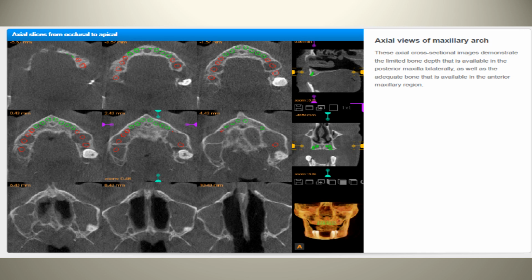And from the cost perspective, when you start breaking down the business side of the profession, a typical CT scanner, at least a good one, is at least $100,000, plus the regulatory aspects of having it inside your office. Not to mention, you need a computer or an acquisition station, up-to-date software, and you need to train your staff on how to use it.